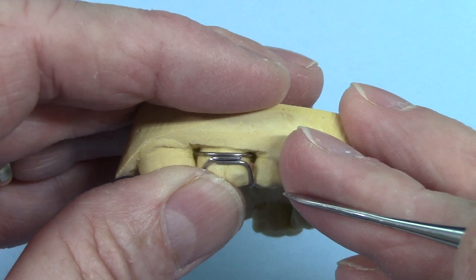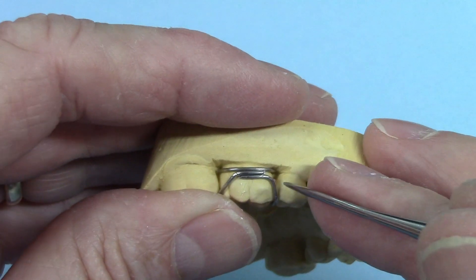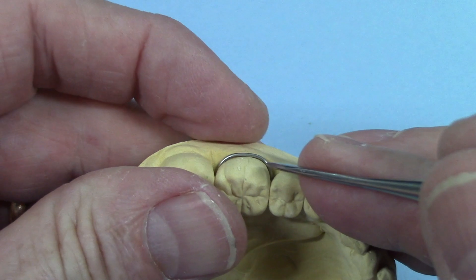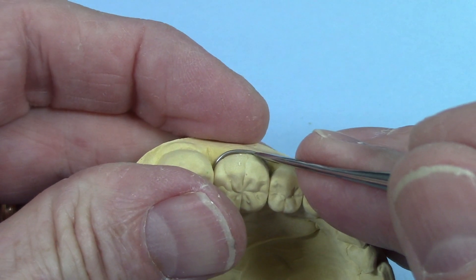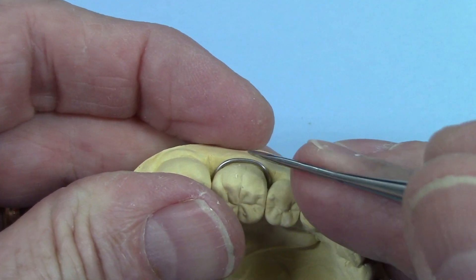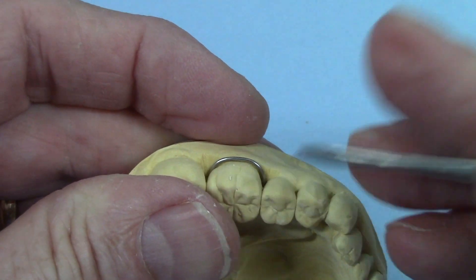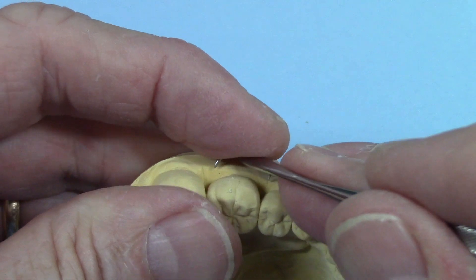That's going to be the basis for a pretty good solder joint. Another thing I like to do is bend the wires so they're going to be just a little bit away from the model. With it being just a little bit away from the model, that gives the solder the ability to wrap around the wire and it's not fighting to get between the wire and the plaster.